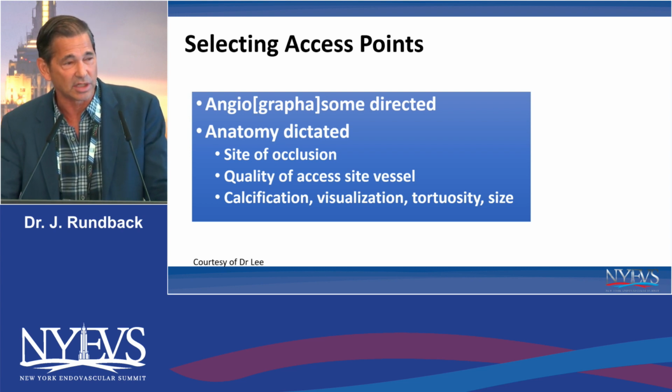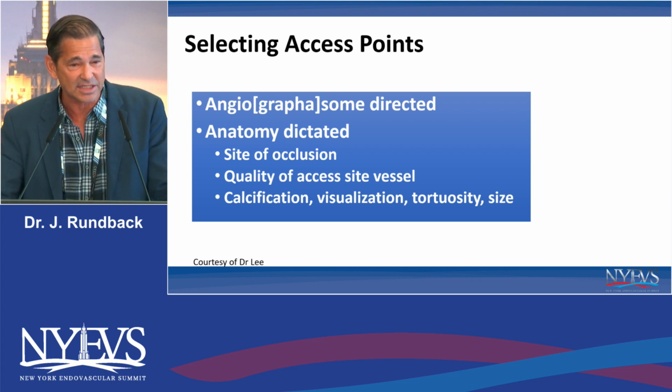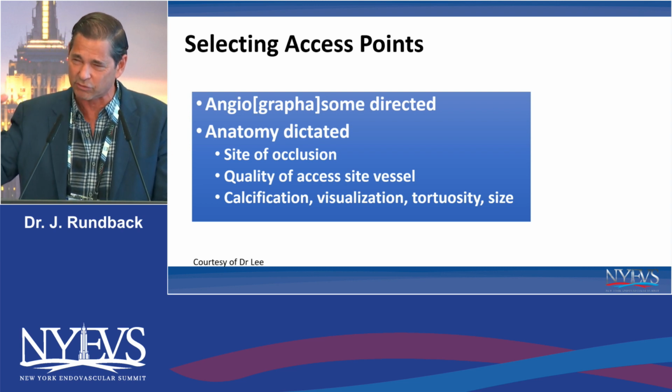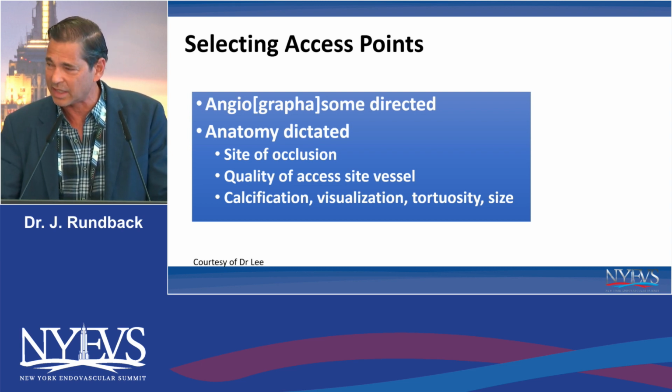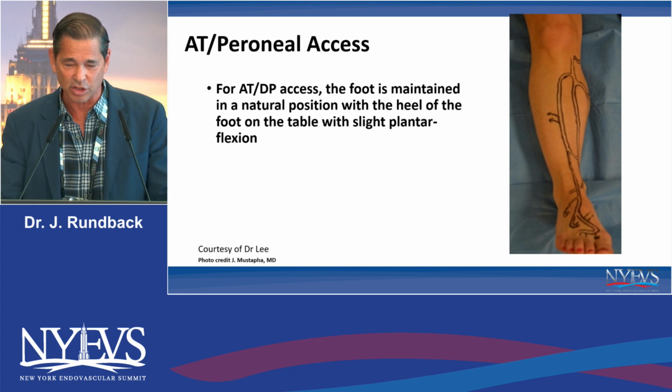That's definitely more challenging. And certainly within an outflow vessel, you're going to try to find a spot that's a little less calcified, a little better caliber, and also gives you some working room so you can get your wires in before you hit that distal cap. And this all plays in this whole idea of the anatomy of the vessel, calcification, tortuosity, and so forth.